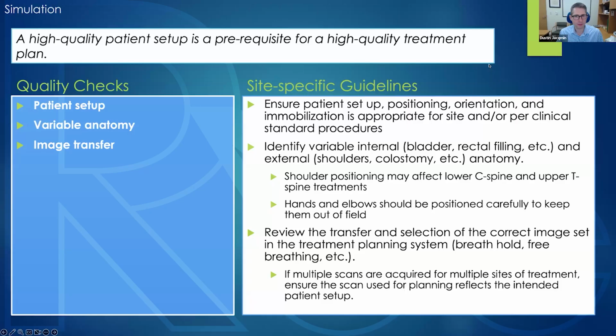Let's talk about simulation. With palliative care, simulation often ends up being fairly simple. We want the patient to be comfortable, but we also want to set them up and position them as quickly and safely as possible. Generally, we try to use fewer resources for these cases as well, to keep the cost of care down. There are some specific things related to palliative care where certain patient setup challenges are important to consider.